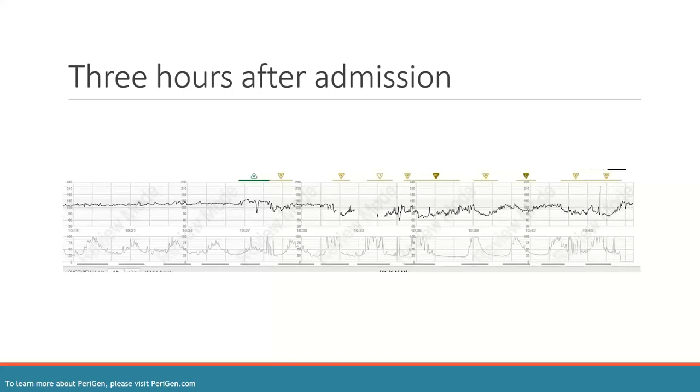So here we are. 20 minutes after the epidural is placed, the patient went to complete and she started pushing. Fetal heart rate is category 2 and appears not to be tolerating pushing with every contraction. UCs are 2 minutes apart. What should we do to assist with fetal tolerance of second stage?